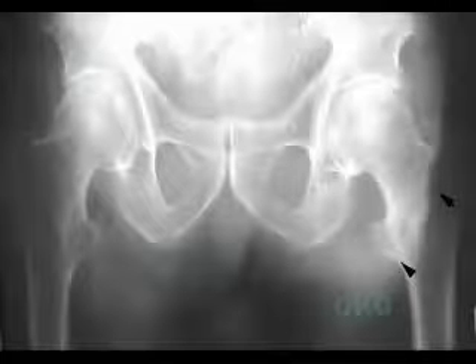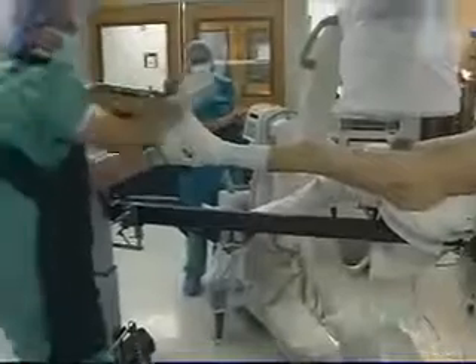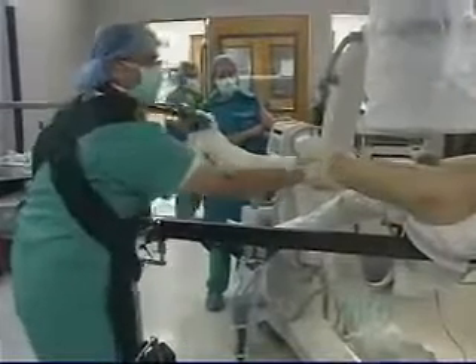This x-ray of an elderly woman shows a stable pertrochanteric fracture on the left. Usual reduction is performed by internal rotation and traction. Abduction or adduction occasionally is required in order to get a good angle.